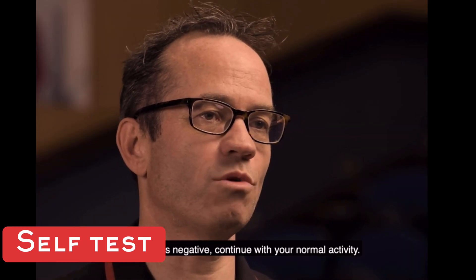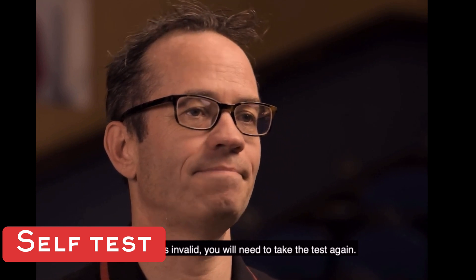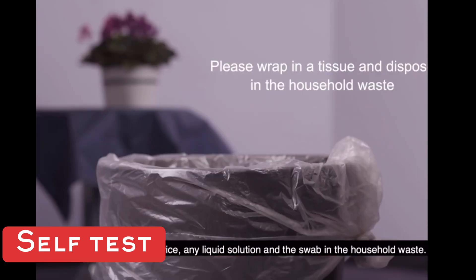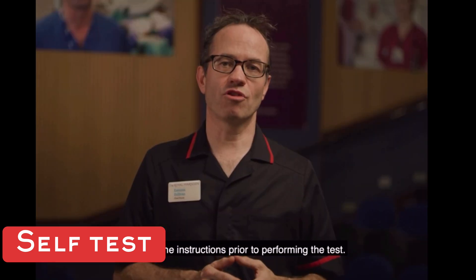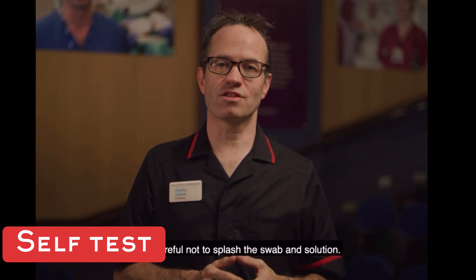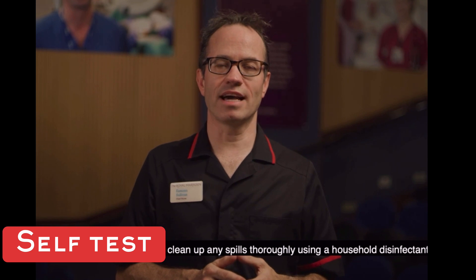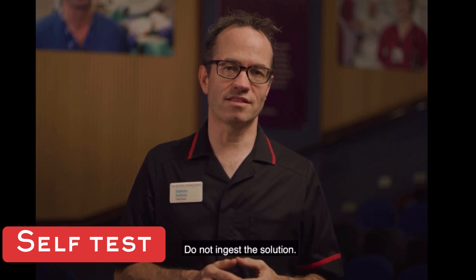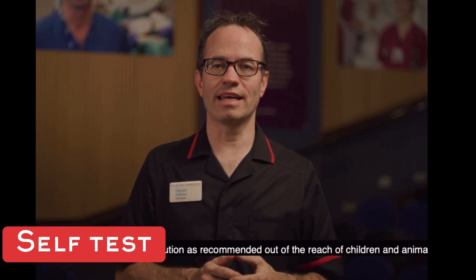If the test is negative, continue with your normal activity. If it is invalid, you will need to take the test again. Dispose of the device, any liquid solution, and the swab in the household waste. Key points to remember: read the instructions prior to performing the test; do not eat or smoke while handling your specimen; be careful not to splash the swab or solution. If you have an accident, clean up spills using a household disinfectant. Do not ingest the solution, and store it out of reach of children and animals.